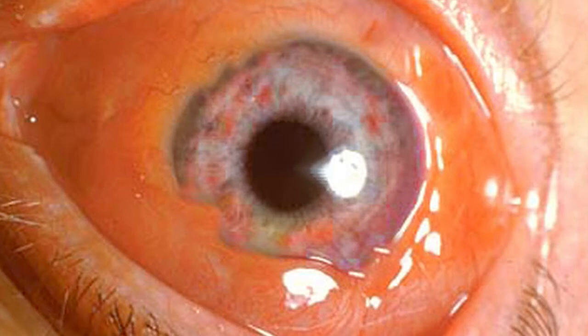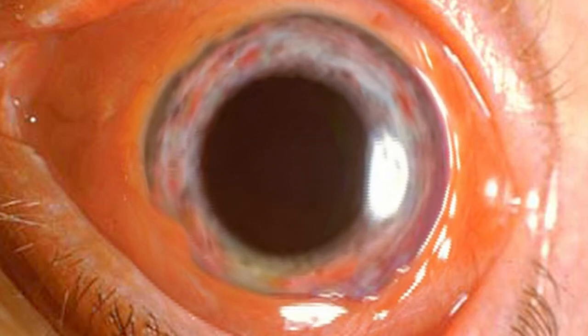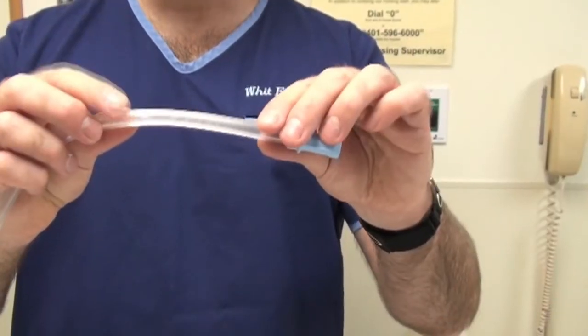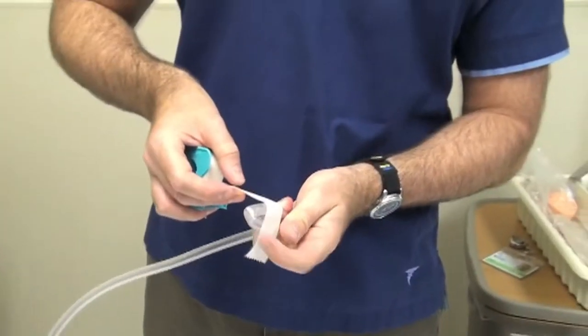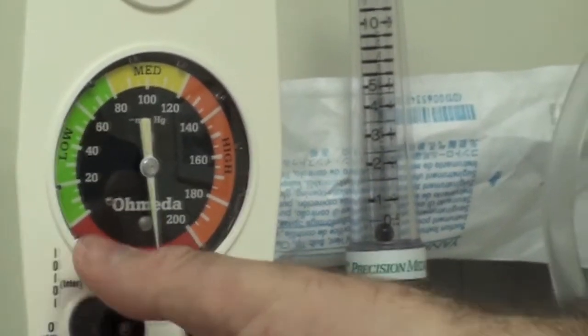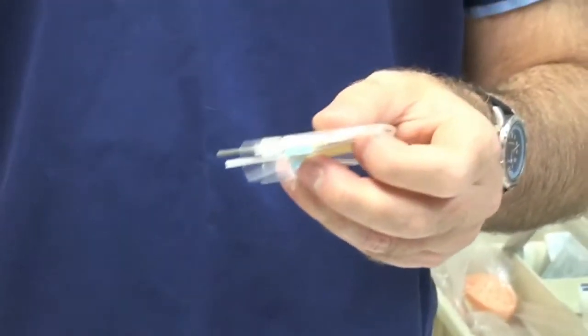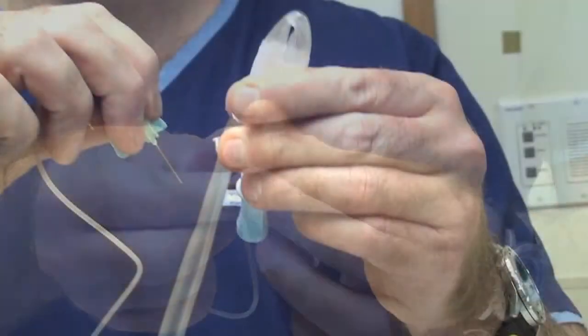To remove a hard contact lens, apply some topical anesthetic to the patient's eye. While it takes effect, kink over some suction tubing and tape the end down. Turn on the suction, then take a butterfly needle and remove the little gray vacutainer needle from one end.